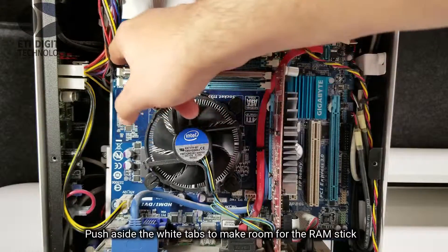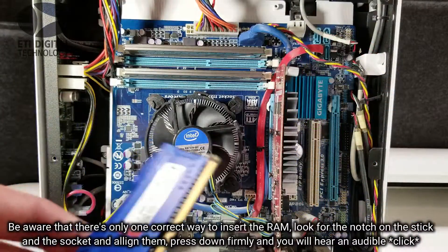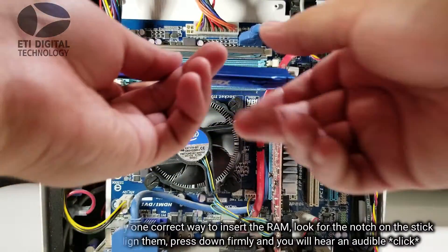Push aside the white tabs to make room for the RAM stick. Be aware that there's only one correct way to insert the RAM — look for the notch on the stick and on the socket and align them. Press down firmly and you will hear an audible click.